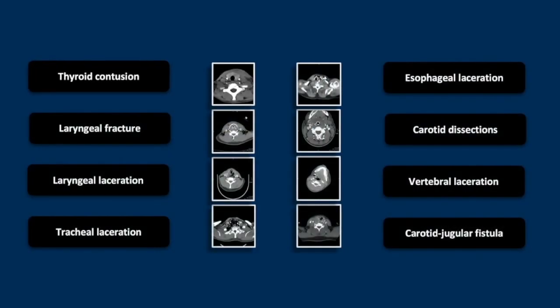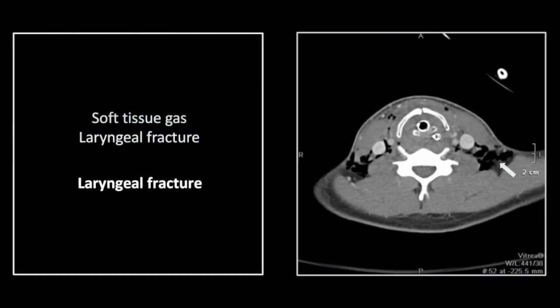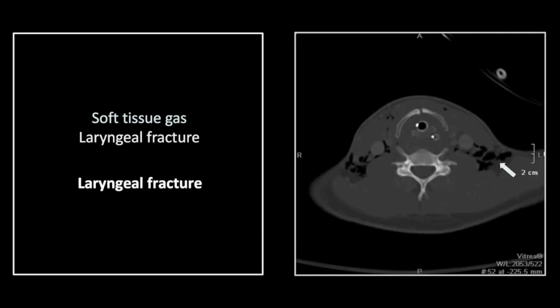Our next case is a fracture of the laryngeal cartilage. There is a good deal of soft tissue gas in the cervical soft tissues. Here in the anterior midline, in the laryngeal cartilage, there is a linear hypodensity. On bone windows, you can see the soft tissue gas and the rupture of the anterior laryngeal cartilage. There is adjacent ill-defined sclerosis, most likely related to the bending of this cartilage prior to its fracturing.